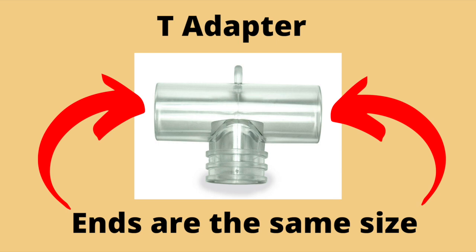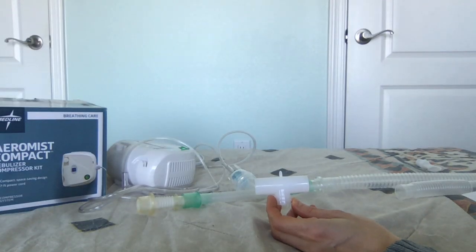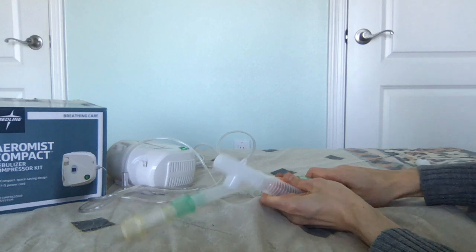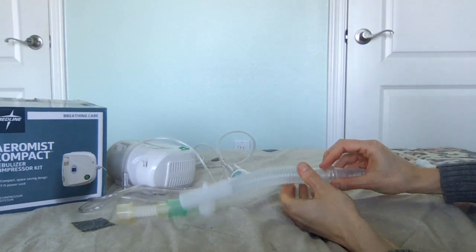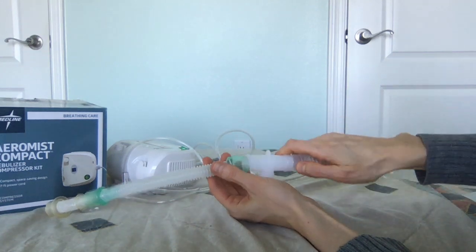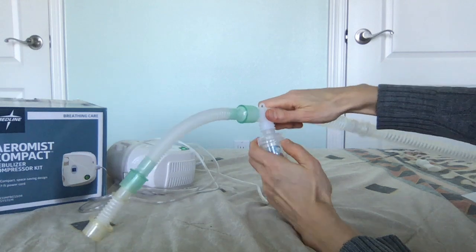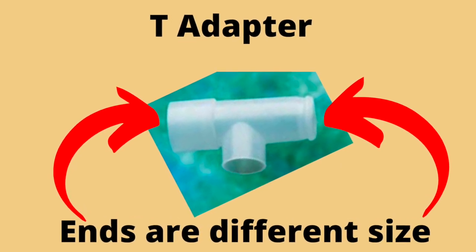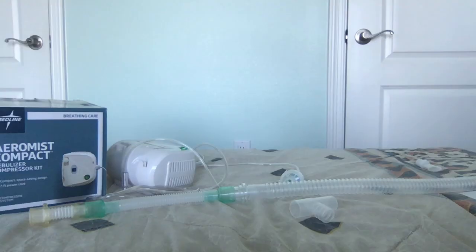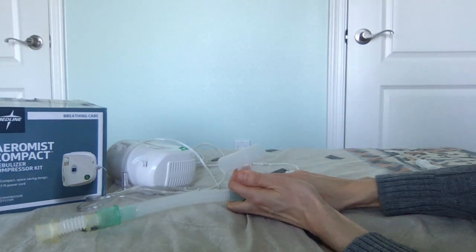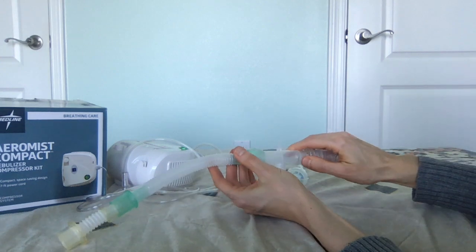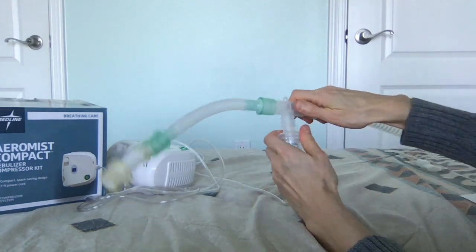The T-adapter comes in two basic forms. One T-adapter is the same size at both ends — if this is how yours looks, you will need to attach the reservoir tubing. Simply attach the reservoir tubing, connect it to the exhalation valve, then connect the rest of the tubing to the T-adapter. Now insert the nebulizer canister and you can nebulize. If your T-adapter has one small end and one large end, you can connect it directly to your ventilator tubing. The large end connects into your exhalation tube, the smaller end connects into the rest of the tubing. Attach the nebulizer canister and you're ready to nebulize.